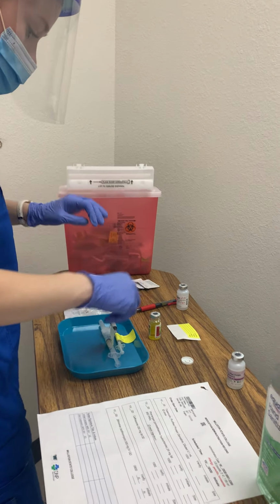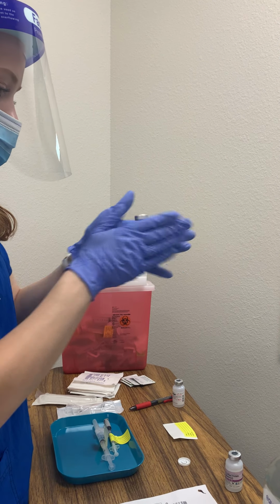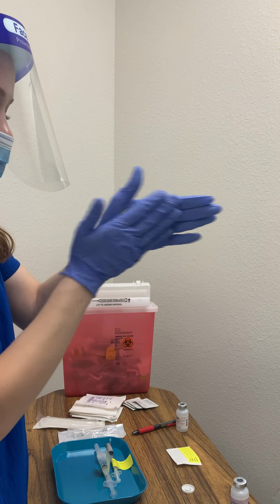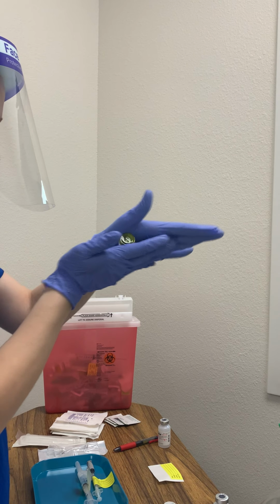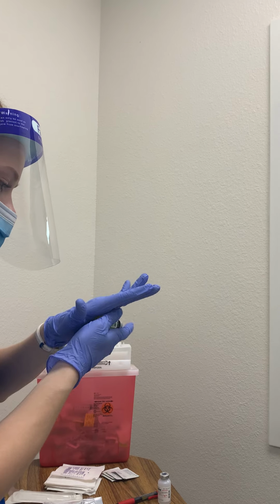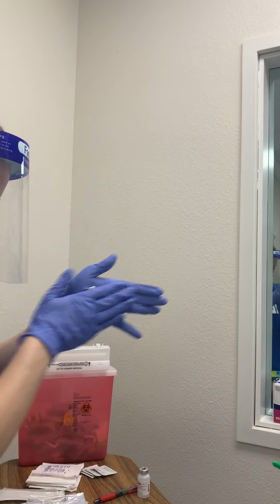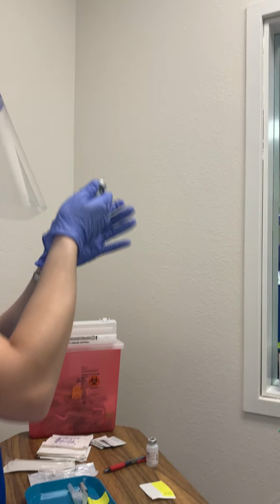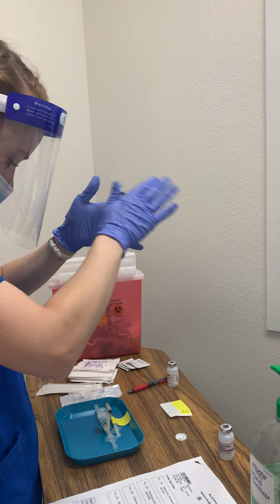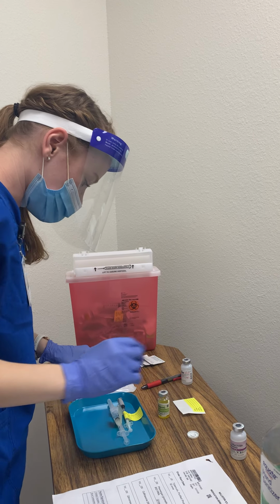So then I can put this in the sharps, and then I'm gonna, not vigorously, but just enough to mix it to make sure it's evenly distributed. I'm gonna roll this back and forth. And you usually would do this longer, but for video purposes, just a little bit longer, just got a couple flecks in there. Okay, so perfect. So we got my ceftriaxone.